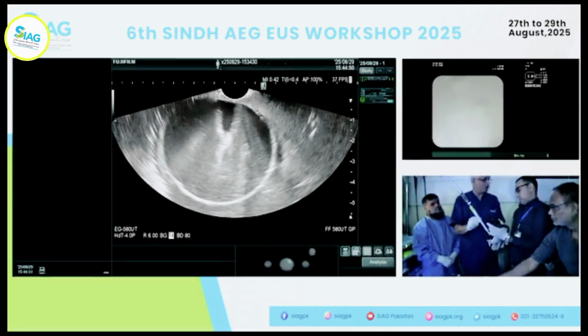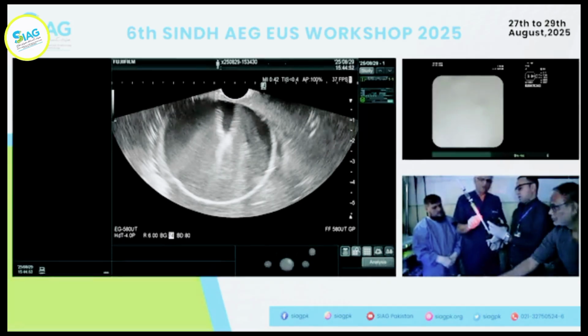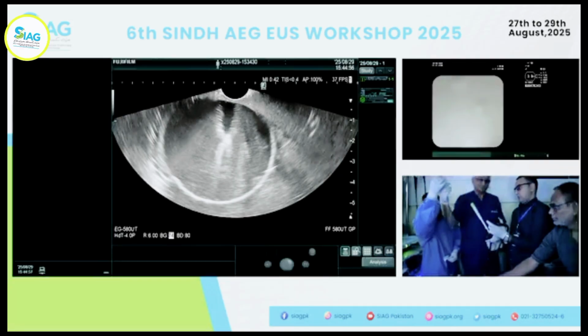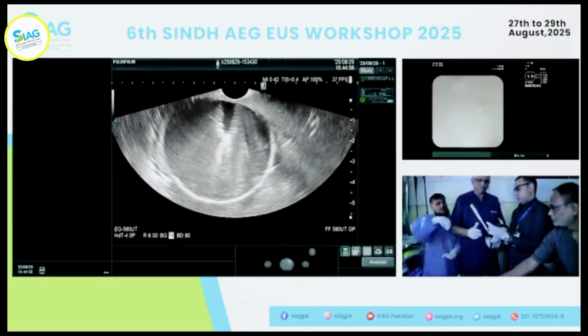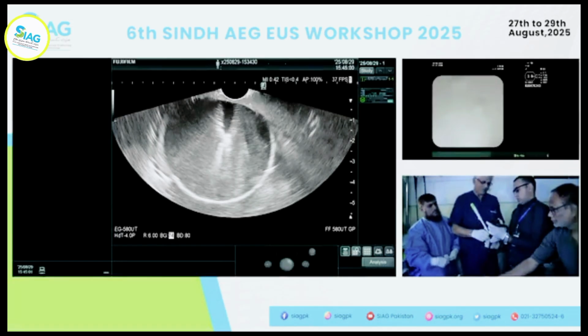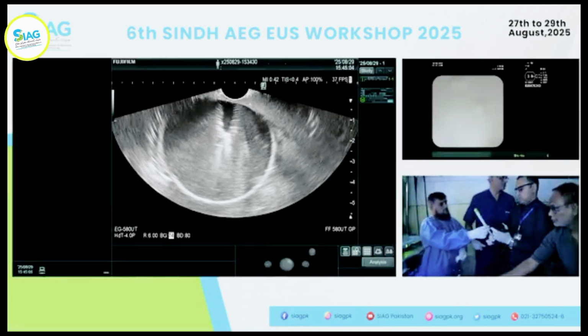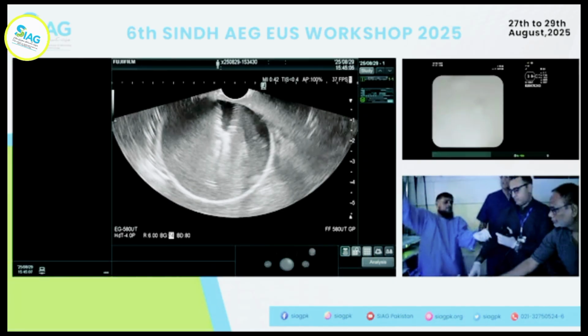Now you pull the needle back, you lock it, right? You will take this out. Now everything is good. Now you undo and remove the thing and give it to your recipient. So you can have the second person.